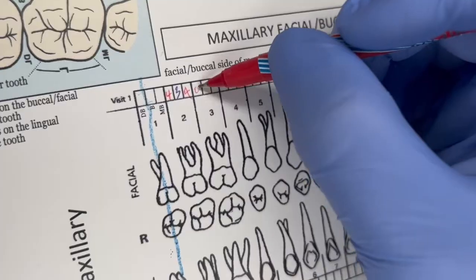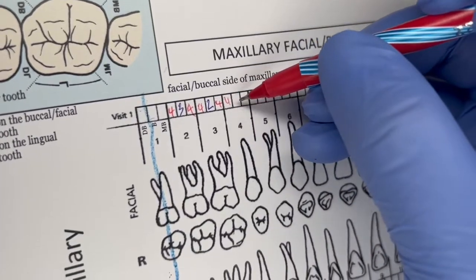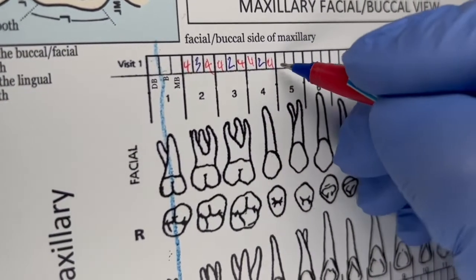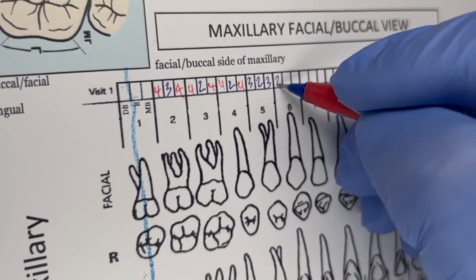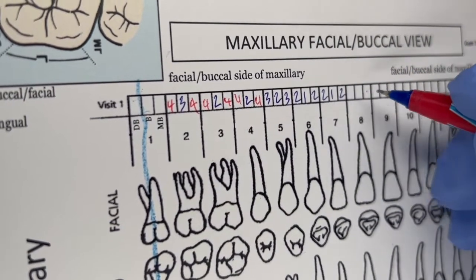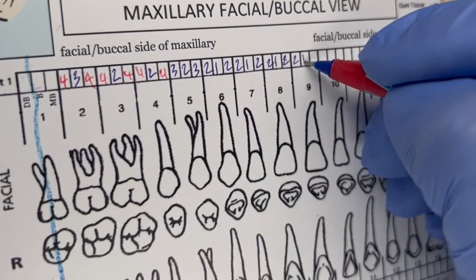Continuing the maxillary facial readings: 4, 2, 4. Then 4, 2, 4. Then 4, 3, 2, 3. Then 2, 1, 2. Then 2, 1, 2. Then 2, 1, 2. Then 2, 1, 2.